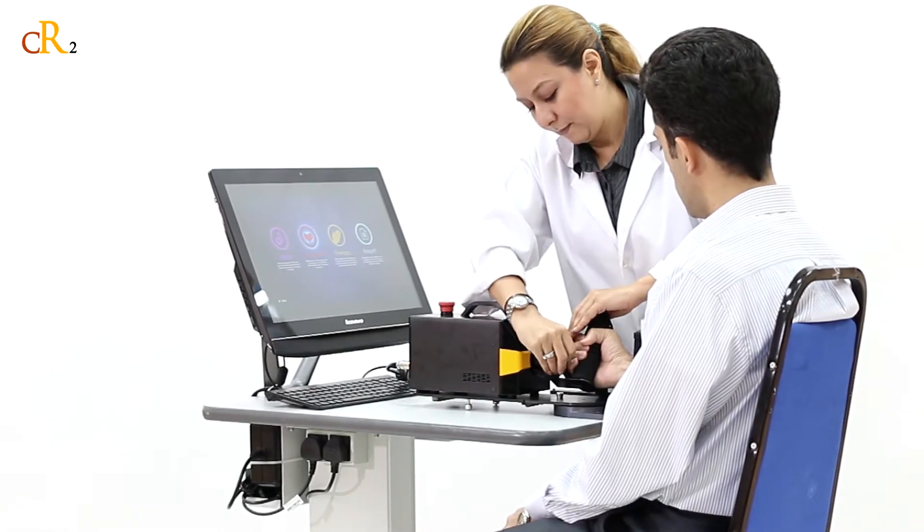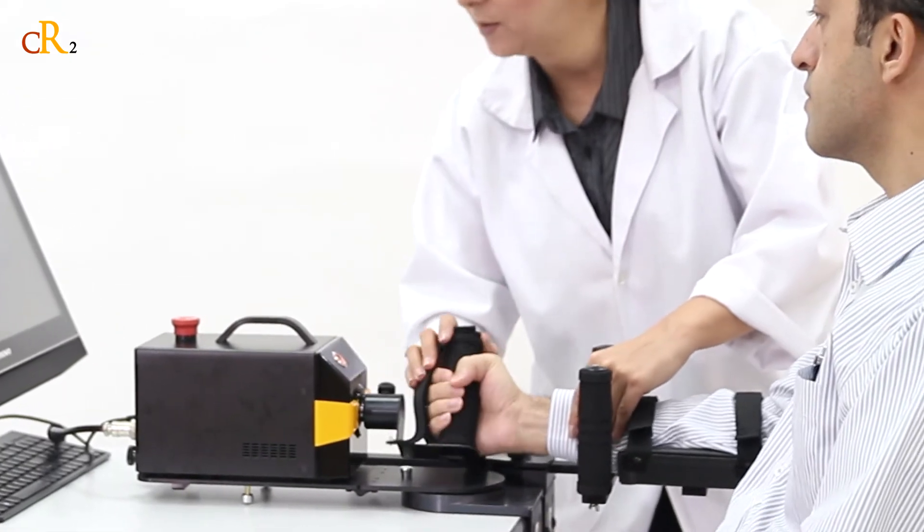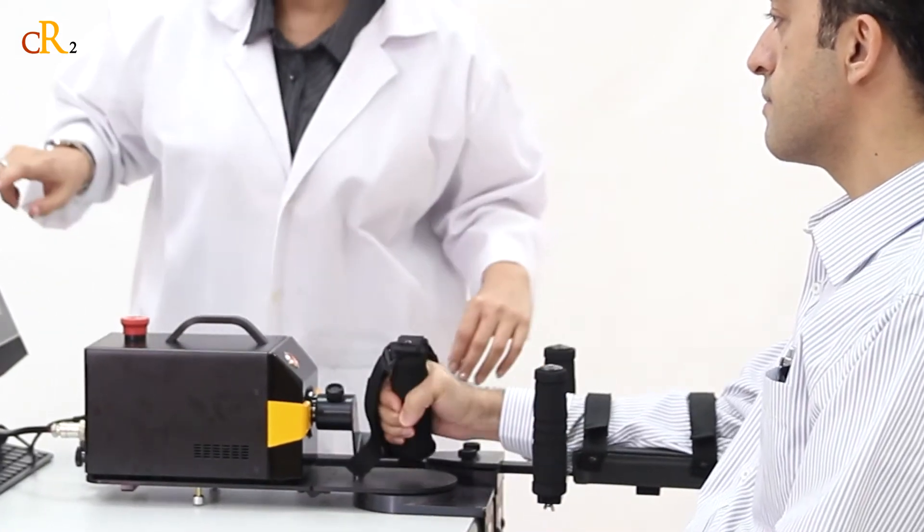CR2 Haptic is a compact and portable rehabilitation robot which provides exercise training for forearm and wrist movement.